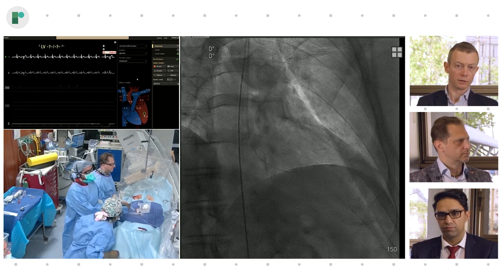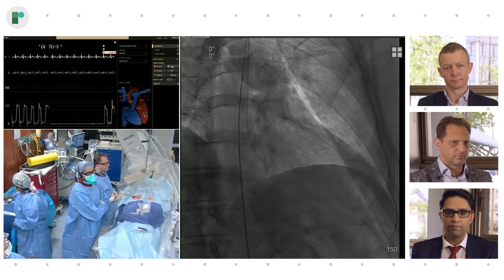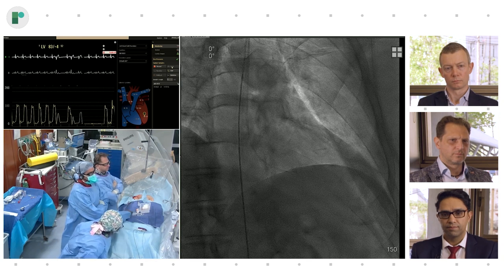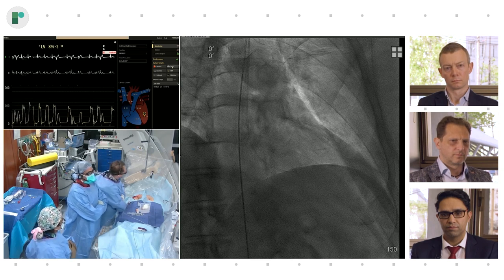Yeah, and again, subclinical thrombosis of the radial is quite frequent. It's about 10%, right? Yeah. He's low. And so you can see that in this situation, because the patient's been NPO, we're actually underhydrated and increasing the risk for the patient. So with an EDP of 11, we'll actually end up giving a 250 bolus.